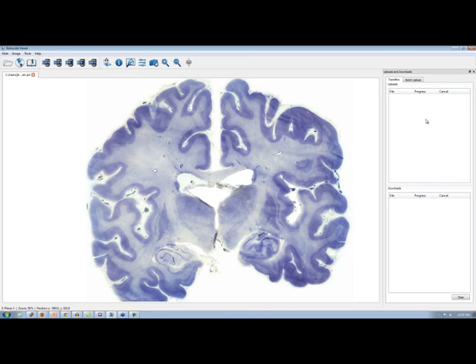If you're using track directories, we have something called a scanning interval, and that interval is user configurable, but it basically says every X minutes scan my directories and look for new images that are there. So what that means is if you say have an interval of 10 minutes, you add an image to a track directory, it's not going to be discovered until that next interval hits. Sure. And that's in comparison to using the viewer to upload images. When you upload through the viewer, those images are immediately found, and you only have to wait for the thumbnail to be generated, and they'll be in the system.